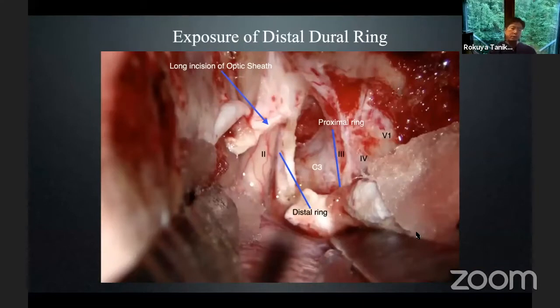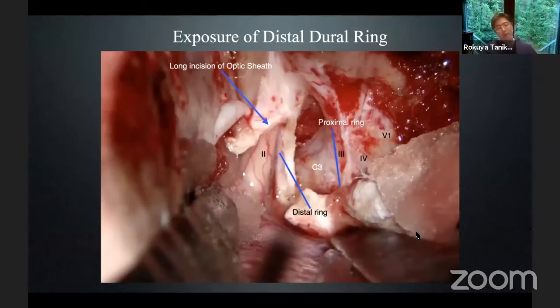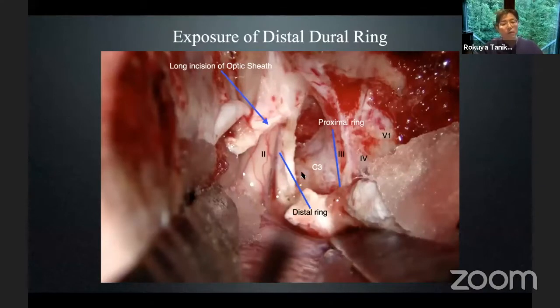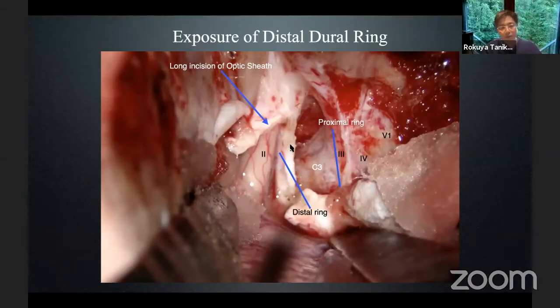After taking out the anterior clinoid process, we can open the optic sheath to decompress the optic canal, if the optic canal is involved by the tumor or something. The proximal ring can be secured, and you can find it right here. This distal dural ring is just a part of the inferior wall of the optic sheath.